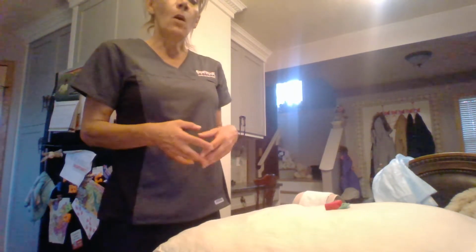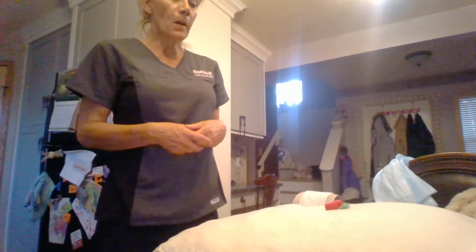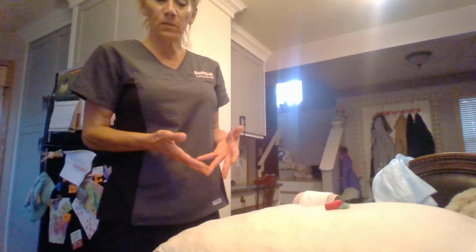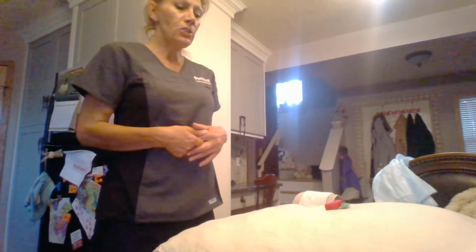The morning is usually when the stoma is less active, or the client themselves may know when the stoma is less active, or you may be changing the system because the bag is leaking. You would change the bag when it's 1/3 full. And so those are the reasons why you may be changing the system.